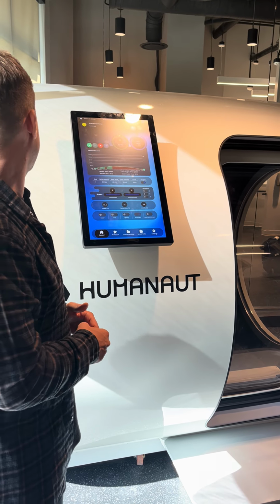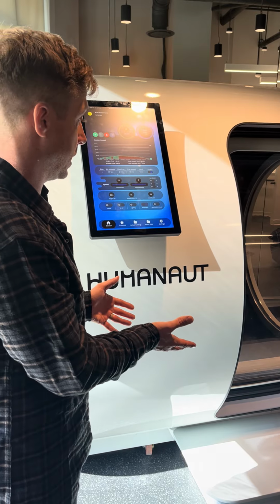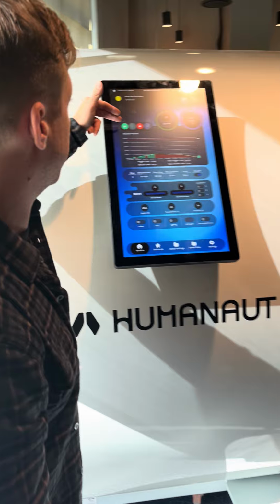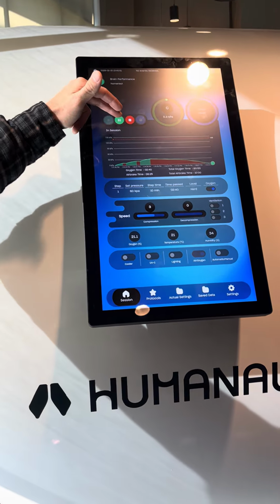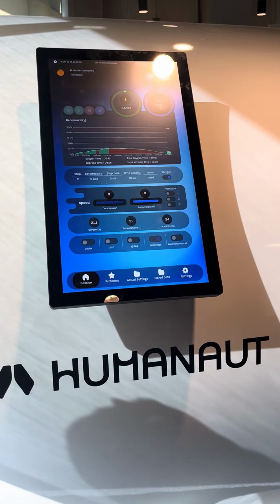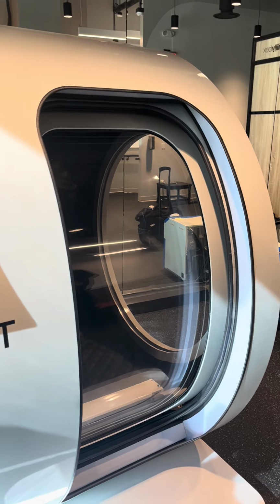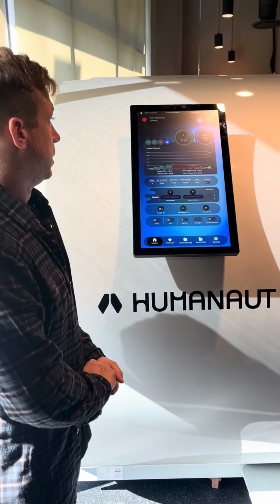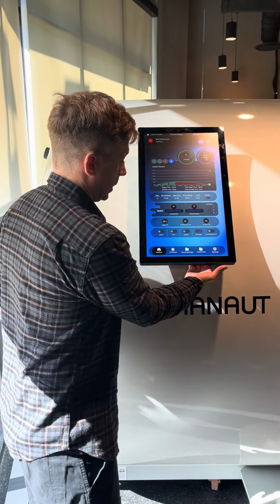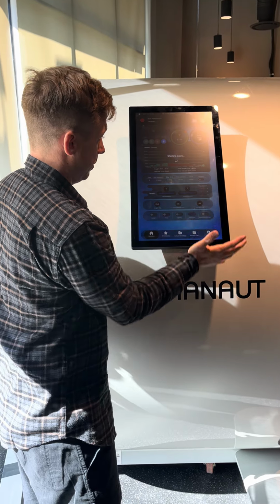Alright. So we're going to let this fully depressurize. Okay, so the door's not opening. It's because we're paused. So I'm going to hit play, and then I'm going to hit stop. Valve's still open. Shut that. For your next session, we're going to power off.